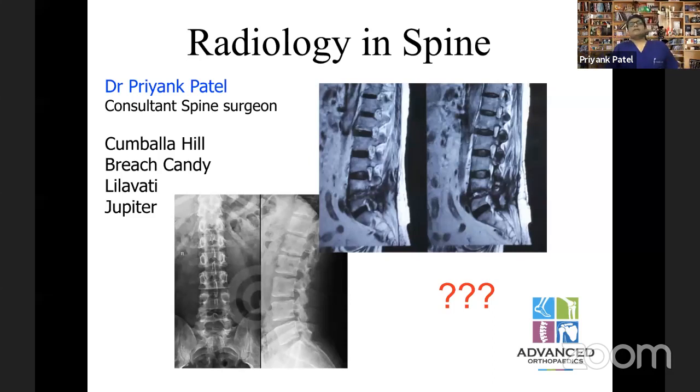Hi guys, good evening. What we are going to talk about today is the radiology of the spine, specifically the MRI. We have already had some discussions on how to go about reading X-rays, and this is a part of the continued series where we are discussing how to read important specific radiology of the different joints. Let's talk about the spine.